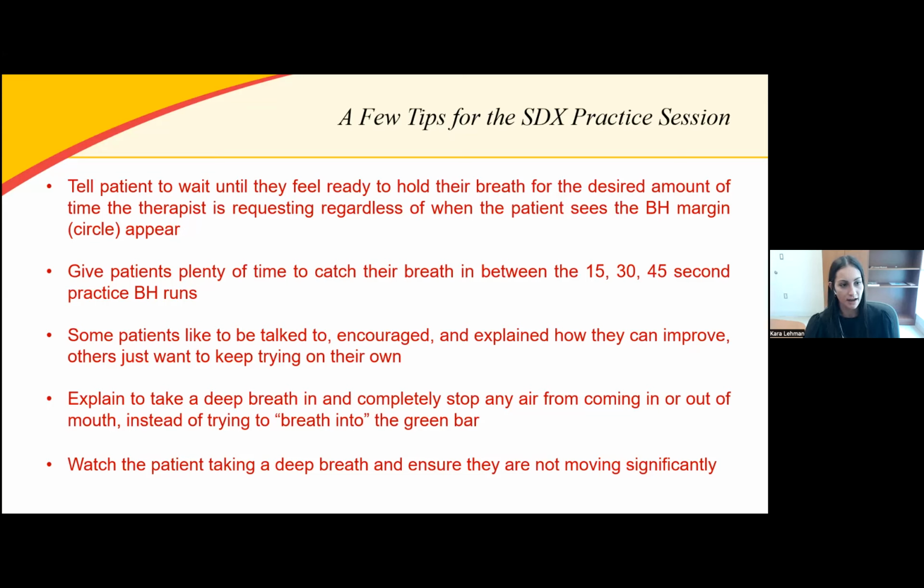And then the last point I have is to make sure you're watching the patient during these trial runs, making sure that when the patient takes a deep breath in and holds their breath within the 75% margin, they're not moving significantly. That will be the level that you want the patient to hold their breath in during the CT simulation scan and also during treatment.